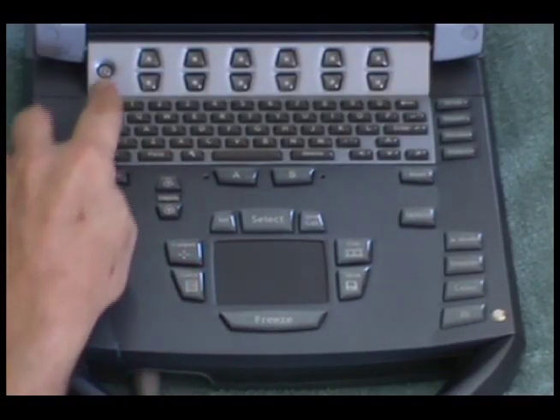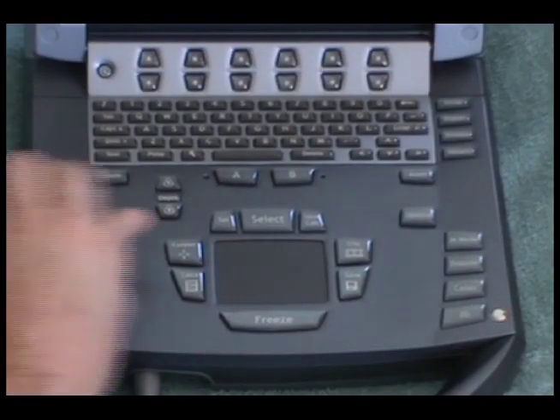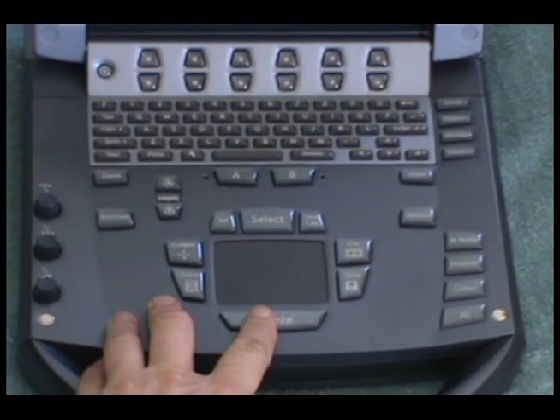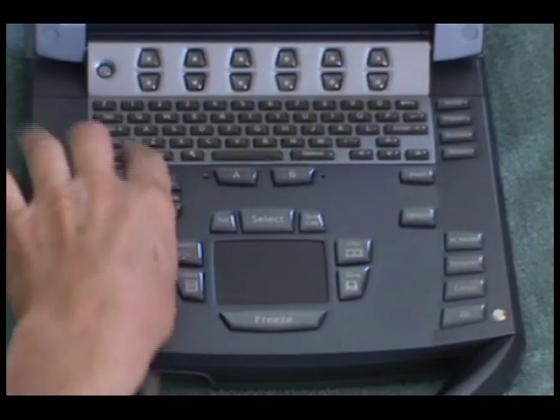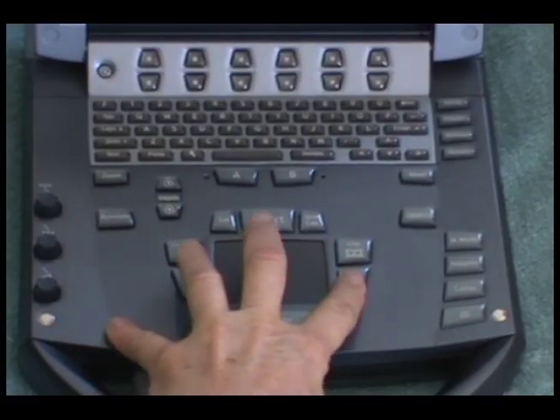frequency, gain, and focal points. We will use the keyboard hand to make measurements, label organs, and save images to the patient record or archive.